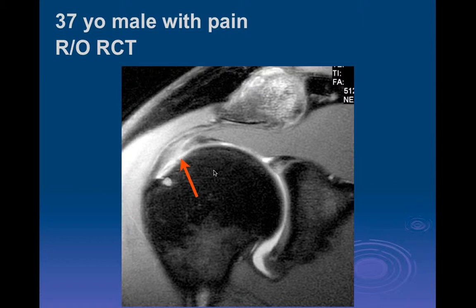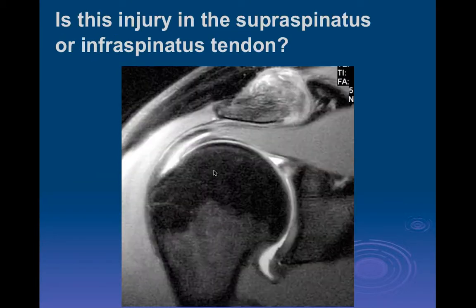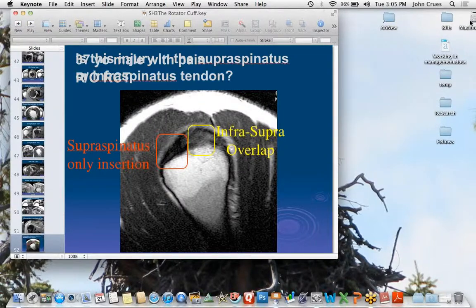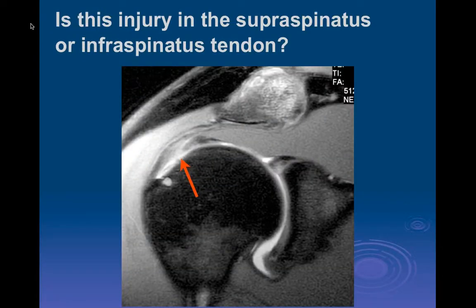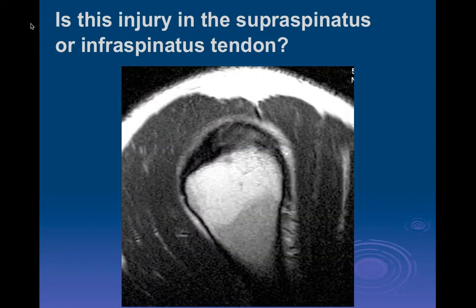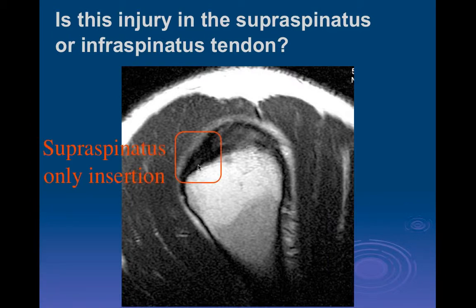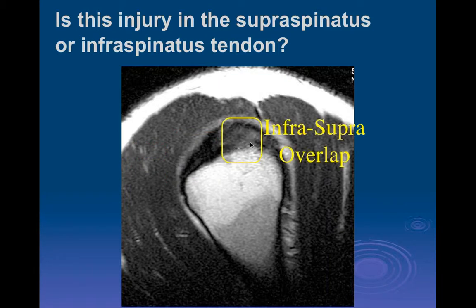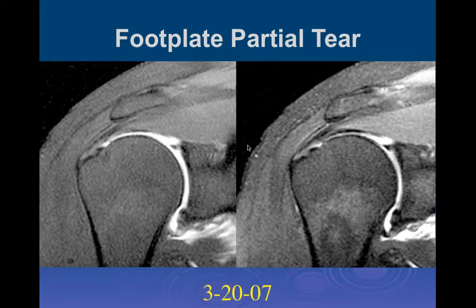This is actually a tear of the infraspinatus, even though it looks like it's in the plane of the supraspinatus, because of the overlap of those fibers where they insert. That makes it a continuous sheet over the superior and posterior aspect of the rotator cuff. On the sagittal images you can see the overlap fiber region: anteriorly you have only supraspinatus tendon, then the overlap region with both infraspinatus and supraspinatus, then more posteriorly the infraspinatus, and further down the teres minor insertions.